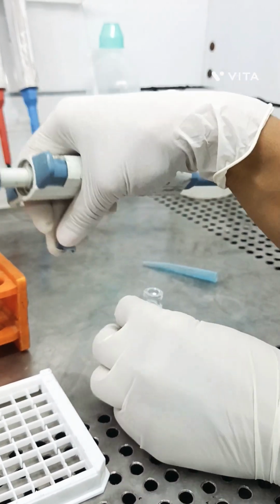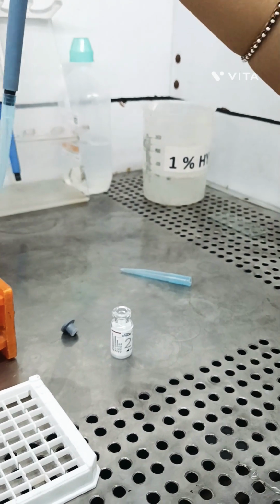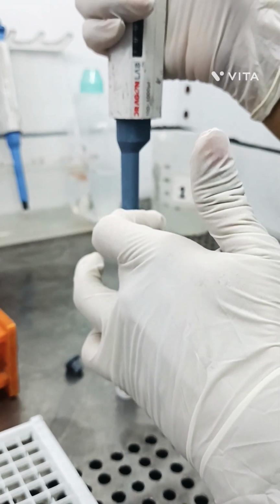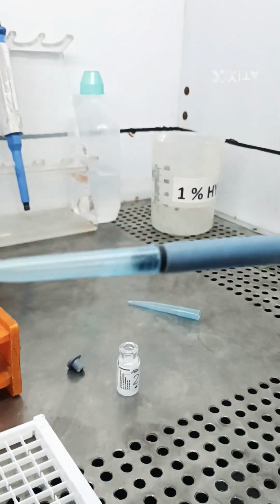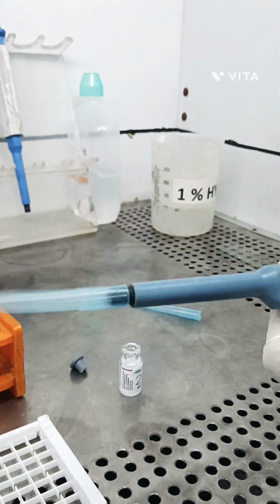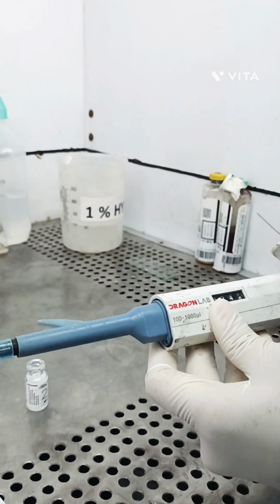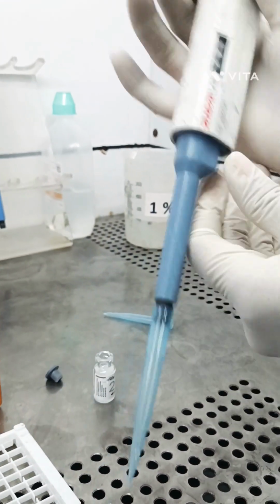So 1.2 ml means 1200 microliter. If you don't have a 2000 microliter pipette, take a 1000 microliter pipette. First take 1000 microliter, and in the second step take 200 microliter. So the total amount is 1200, and 1200 means 1.2 ml. So 1.2 ml you have to add to reconstitute the standard.